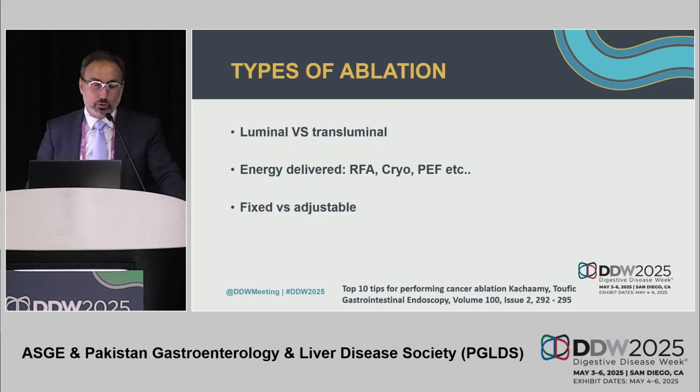I classify ablations into luminal versus transluminal, so whether they are delivered on the mucosal side of the disease or transluminally via endoscopic ultrasound. I also divide them into different modalities based on the energy delivered: radiofrequency ablation, cryotherapy, pulsed electrical field, microwave, etc. And then whether they are fixed versus adjustable. The fixed dose therapies are therapies where you just press on a pedal and a delivery of treatment occurs. As a therapeutic endoscopist taking care of cancer patients, I like the adjustable ones, and I told you why: I like to tailor the therapy to the response.